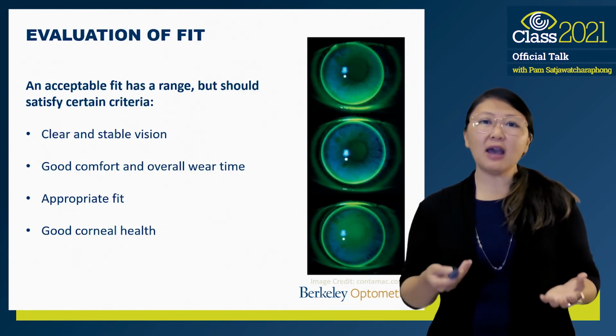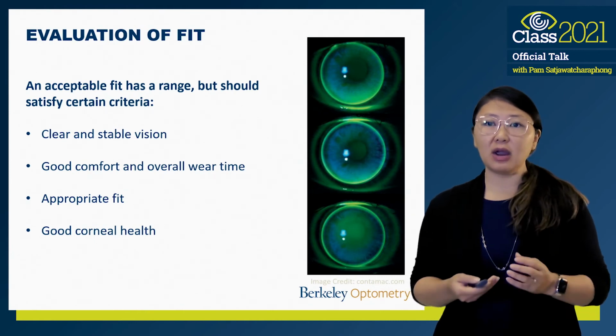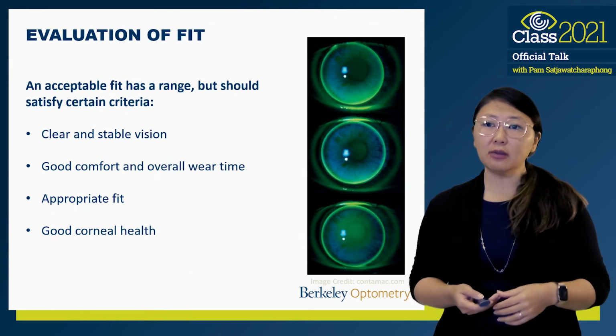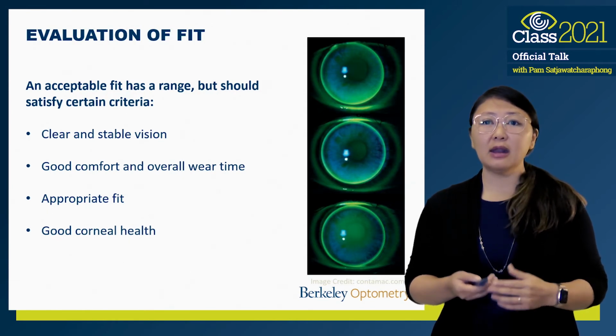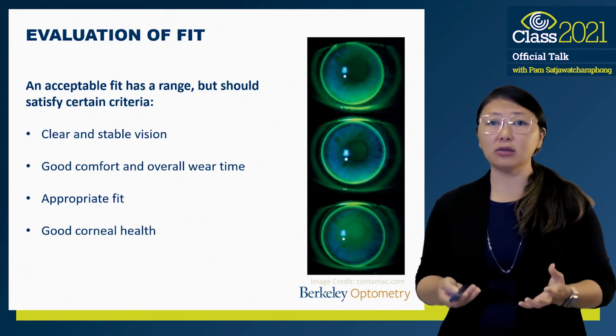So we have found that an acceptable fit has a range. It should satisfy the criteria listed here. Your patient should have clear and stable vision, good comfort and overall wear time, an appropriate fit, and good corneal health. When you remove that lens, the cornea should look healthy.